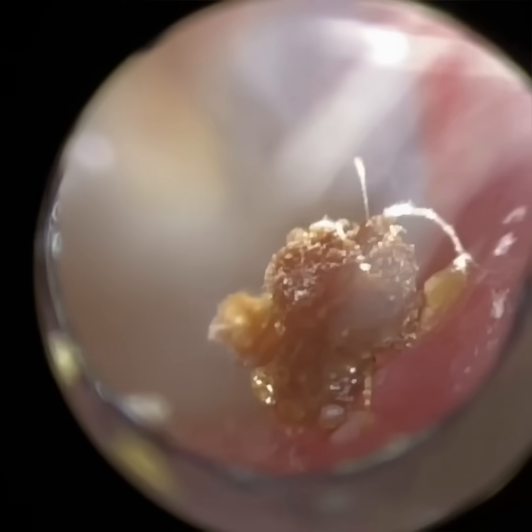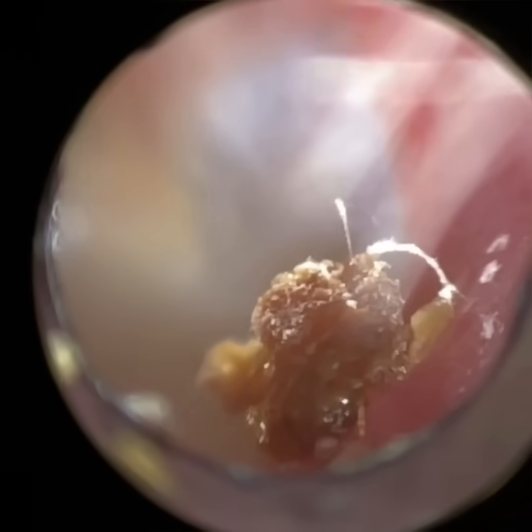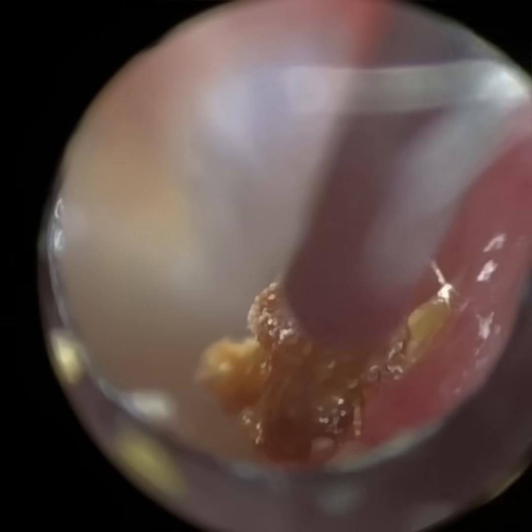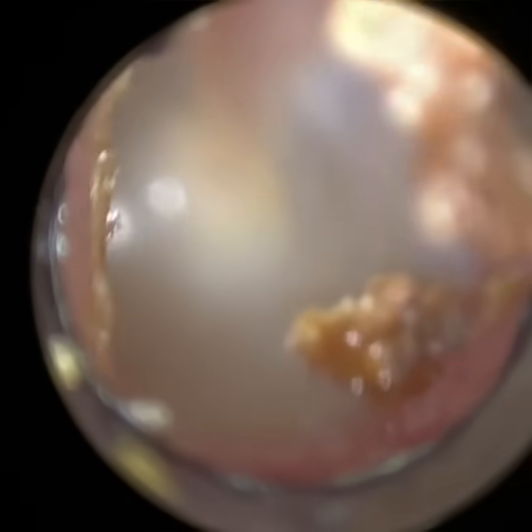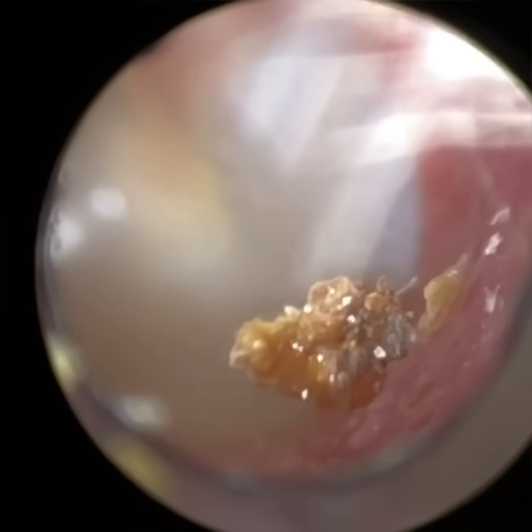I've described that quite a lot, but I'll quickly explain it. If you're on the highway or motorway, the car next to you, if they're speeding past you, is going to go quicker past you than something in the distance at the end of your eye line. And with an endoscope, as you go forwards and back, the wax that's just near the tip of the endoscope is going to be moving quicker than, for example, the ear canal wall, which is a bit further away. We call that motion parallax, and you gain depth perception with that.